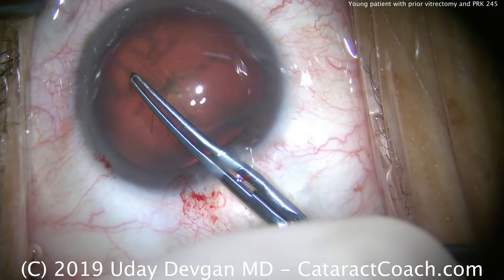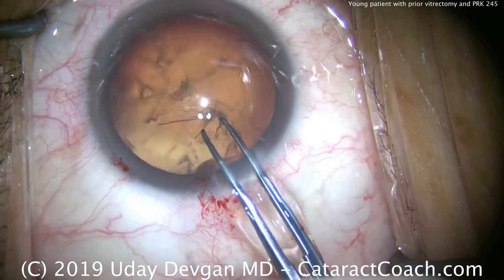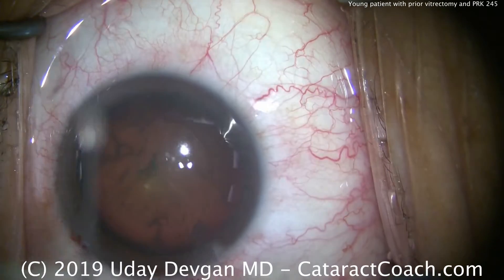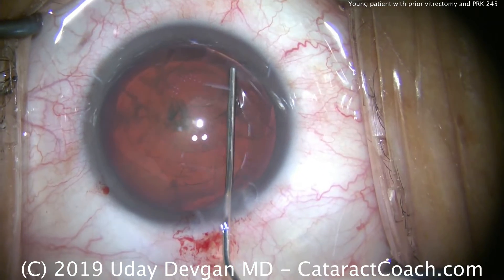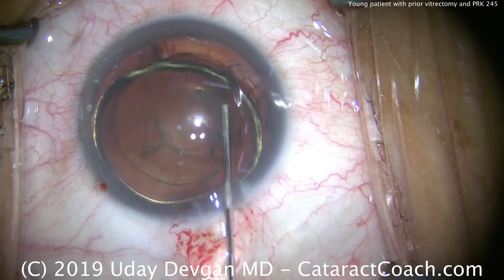Because it's a big eye with large white-to-white, don't use the iris as a guide. We'll finish up the rhexis — it looks just about perfect. If it looks small, it's just because it's a large eye; at the end of the case it'll be a perfect overlap on top of the optic. Hydrodissection is carried out, a little hydrodelineation as well — there's that golden ring, and another golden ring.